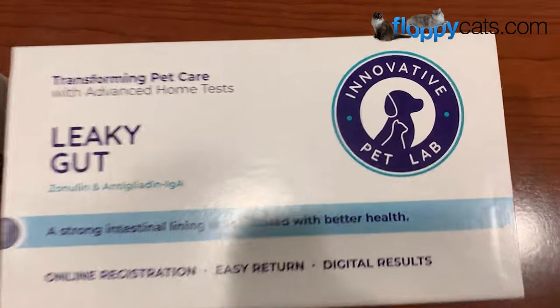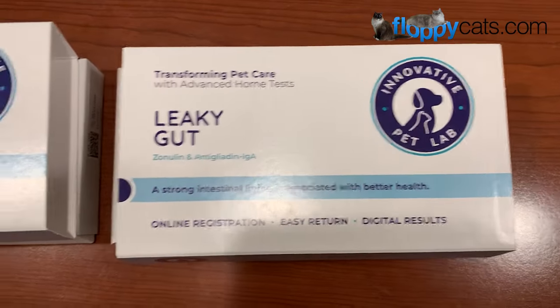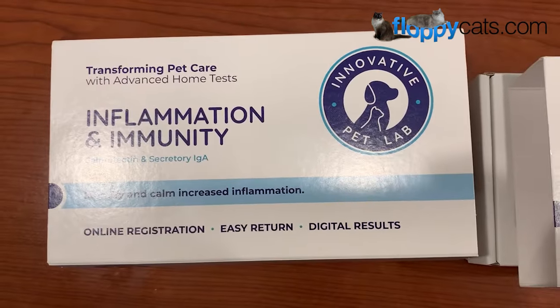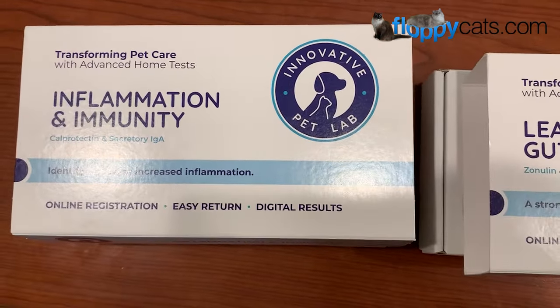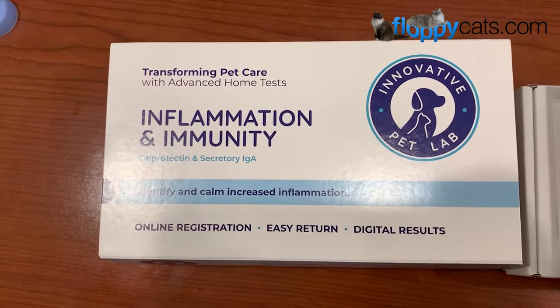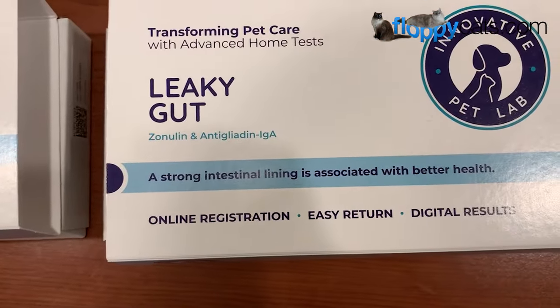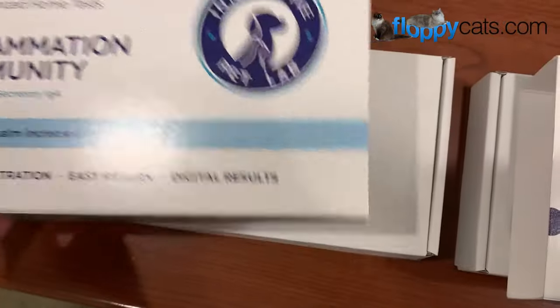Hi Flappycatters! I wanted to introduce you to Innovative Pet Lab. They do multiple different tests that you can do on your cat or dog's stool. They have more options for dogs right now than for cats, but these are the two that I have for cats: one is inflammation and immunity, and the other one is leaky gut. So let's look inside.